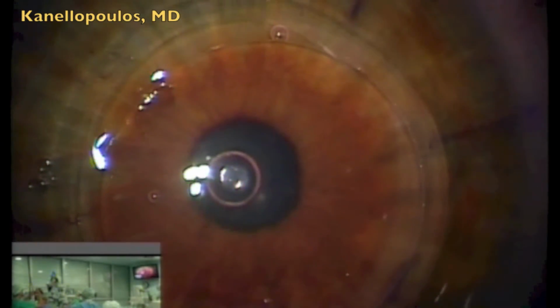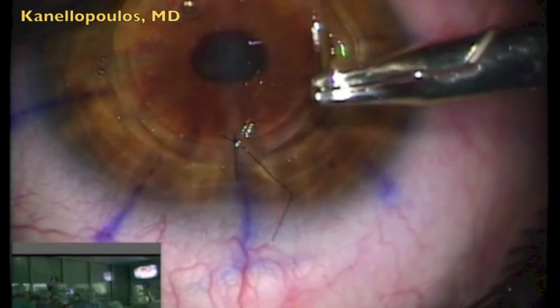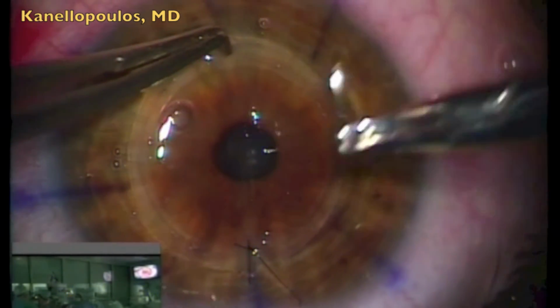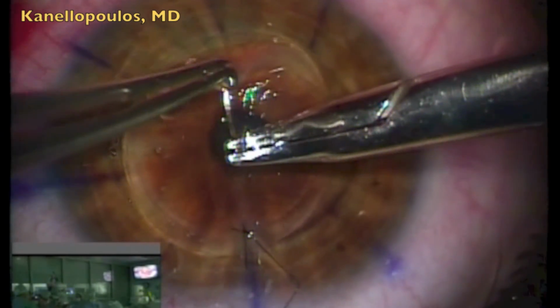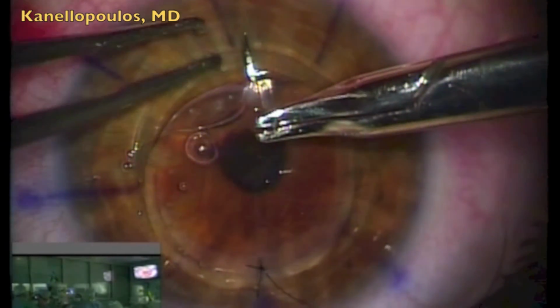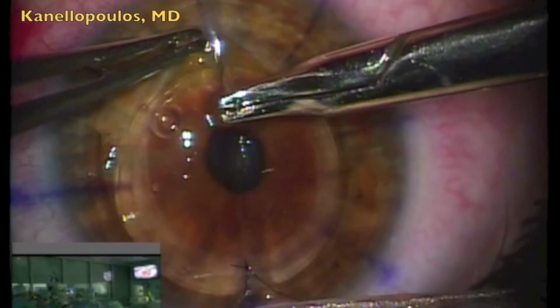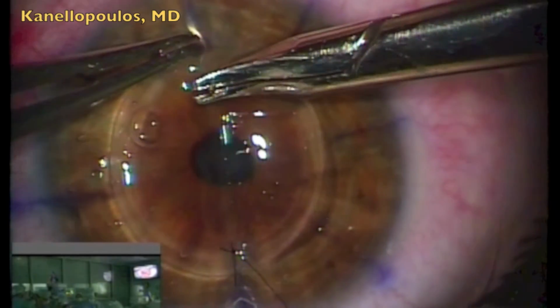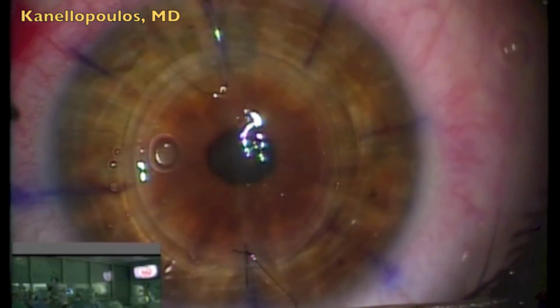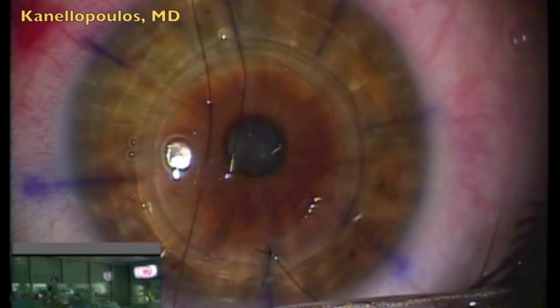This is the first, or 12 o'clock suture, probably the most important suture of any keratoplasty, the second 6 o'clock suture here, as we're splitting the cornea into 2 halves, and again just to illustrate the point of going with our CS needle and 10-0 nylon suture deep into the endothelial layer and trying to reach that same layer on the host here, going to get a reasonable bite, and then square knots and bury the knots of these initial 8 interrupted sutures.